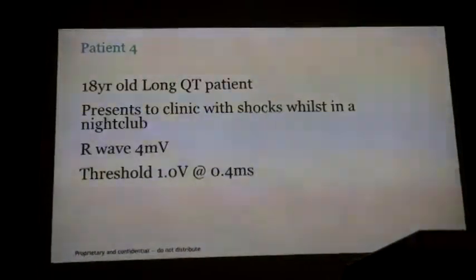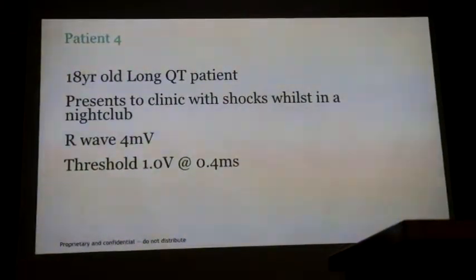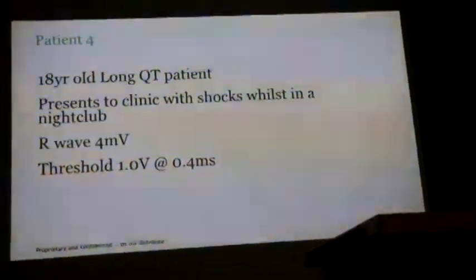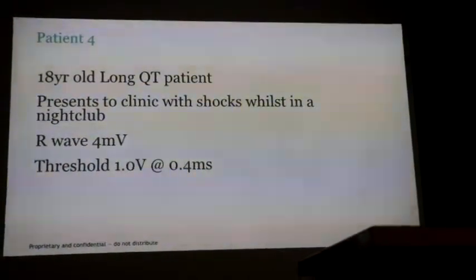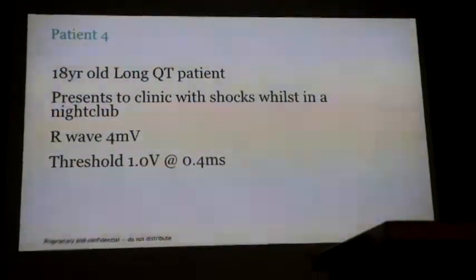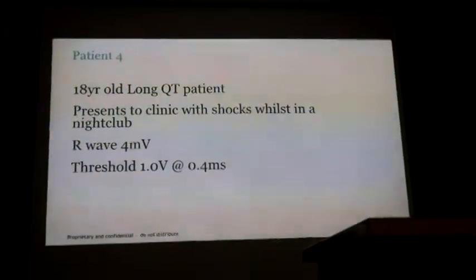Okay, so here's the next patient. This patient, he's 18 years old. He lives in Dublin. Nice little Irish fella. He's got long QT syndrome. He was picked up on screening, so a family member was found to have long QT, arrested. They put a device in. We put a device in. So he presented to clinic with shocks while he was in a nightclub in Dublin. So he's out late Saturday night in the club, enjoying himself, and then his device started shocking him.